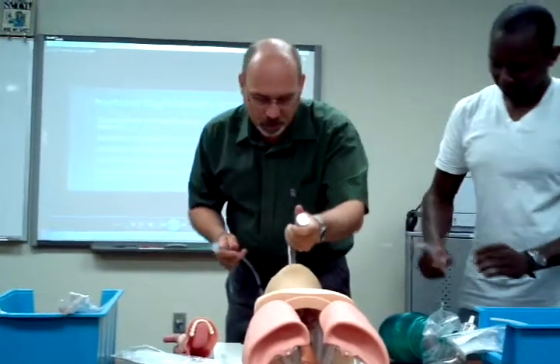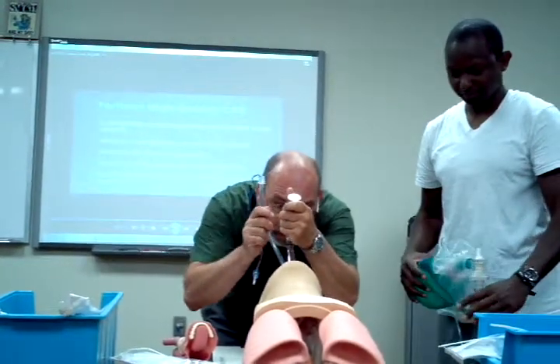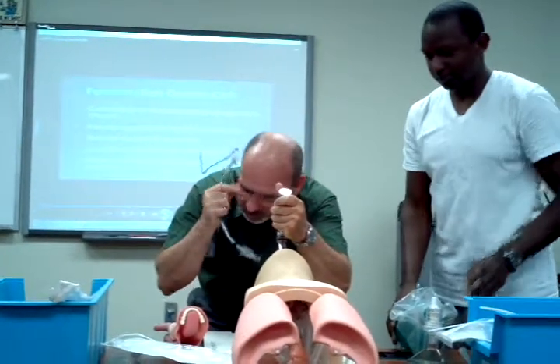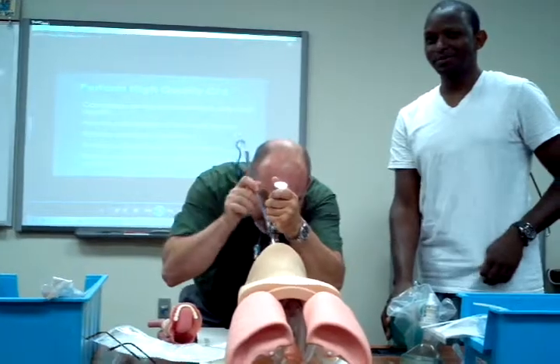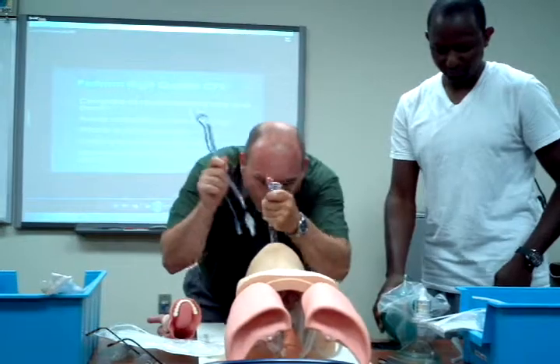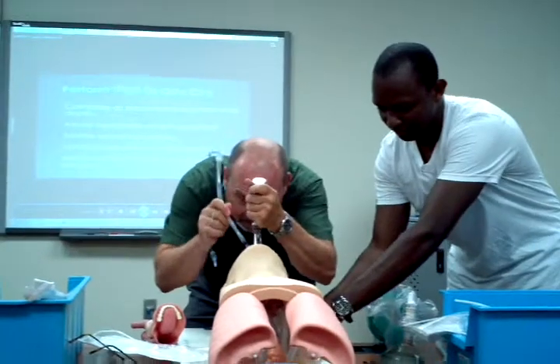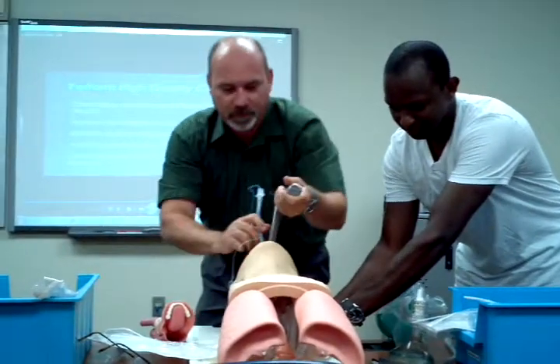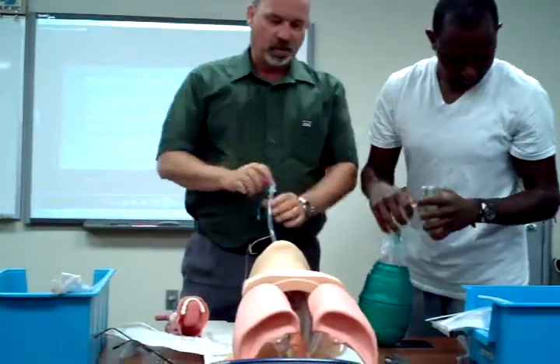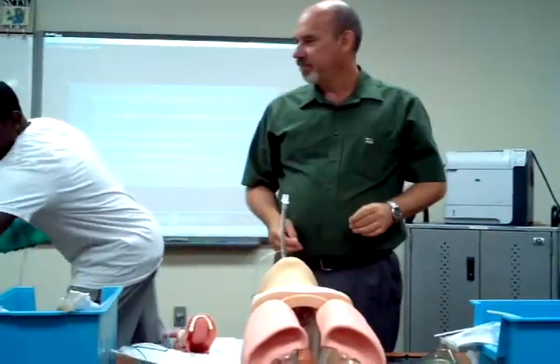I'm ready to make another attempt. I see vocal cords — I didn't take my glasses off this time. Oh, much better. How long have you been, Robert? Fifteen seconds. Maybe you should have lubricated the tube. Style that out.